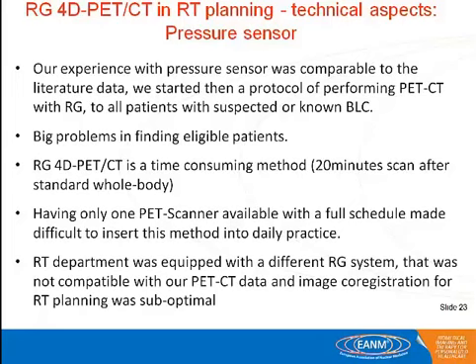And the department also, at the moment, decided to switch from another type of respiratory gated method. So this time there was not any more compatibility. We had to use it only for the diagnosis. So, well, it was a try, but actually we didn't proceed with that. But we didn't give up on respiratory gating. We said, we want to do it again.